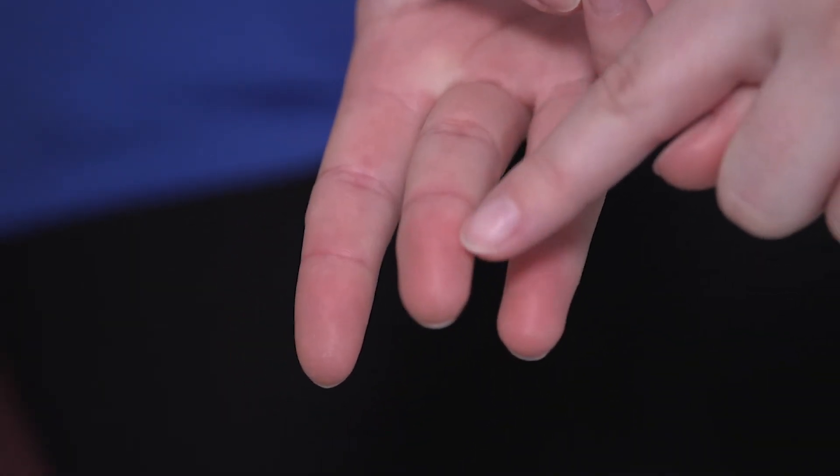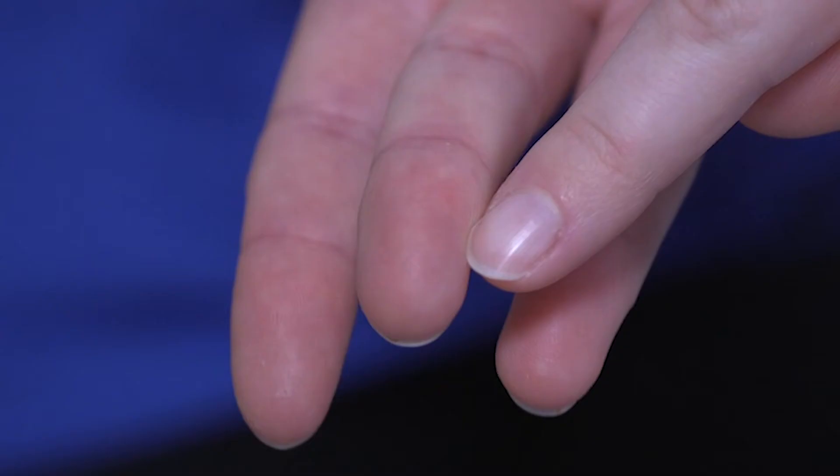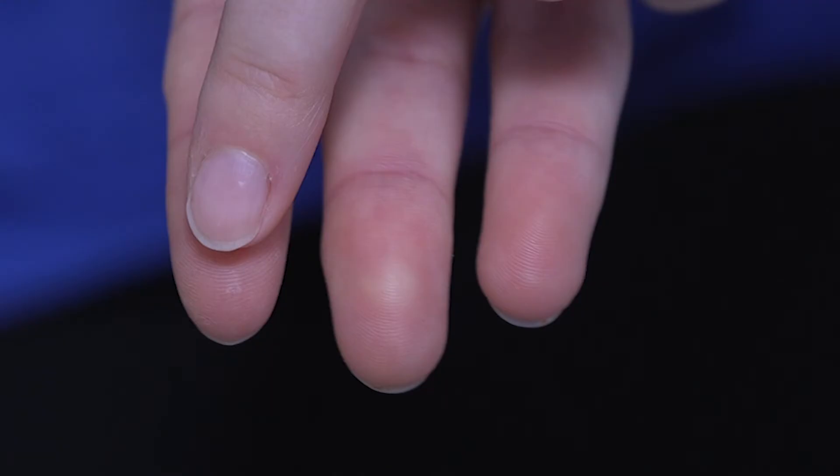The fingers that are best for taking blood samples are these ones. The best area to take a blood sample from your finger is on the outer edge. It is important to avoid the fingertip pad as it will be uncomfortable. Clean the finger with an alcohol wipe. Allow the finger to dry, then get the lancet and press it into the finger.